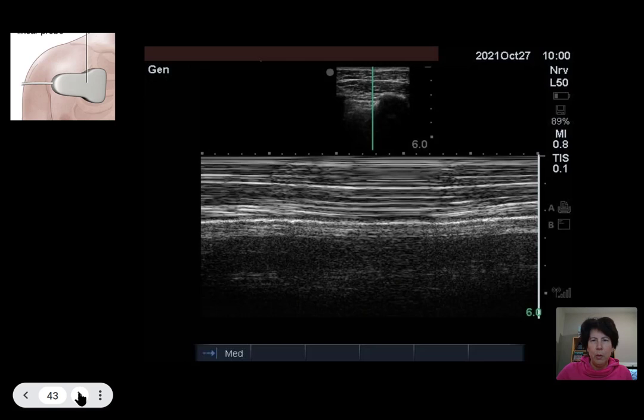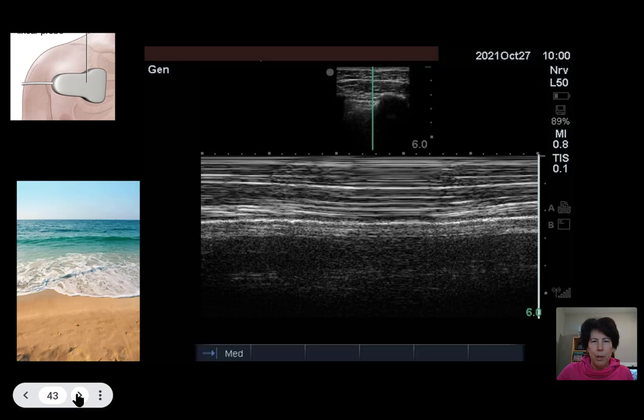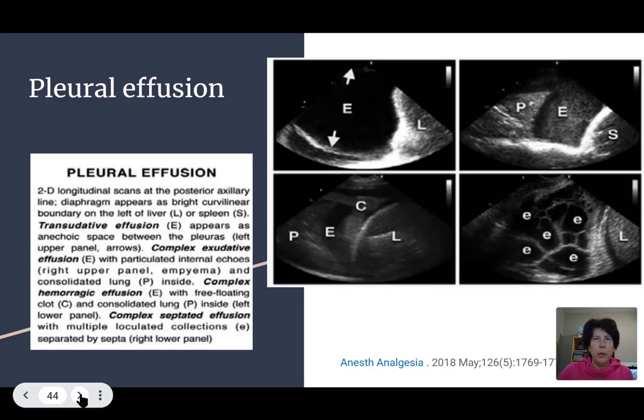And this is M-mode. M-mode, for those who haven't done much before, is just a recording of motion over time. Anything that's in this line, we will be recording what happens to it over time. And that's what a normal M-mode looks like. It's called the seashore. You can get the sense that there's a clear line with a difference below and above. You can imagine that either is the horizon, or the shore. We're going to look at what the barcode or the stratosphere sign looks like later, which is the pneumothorax equivalent on M-mode. Mostly that's what we use M-mode for.